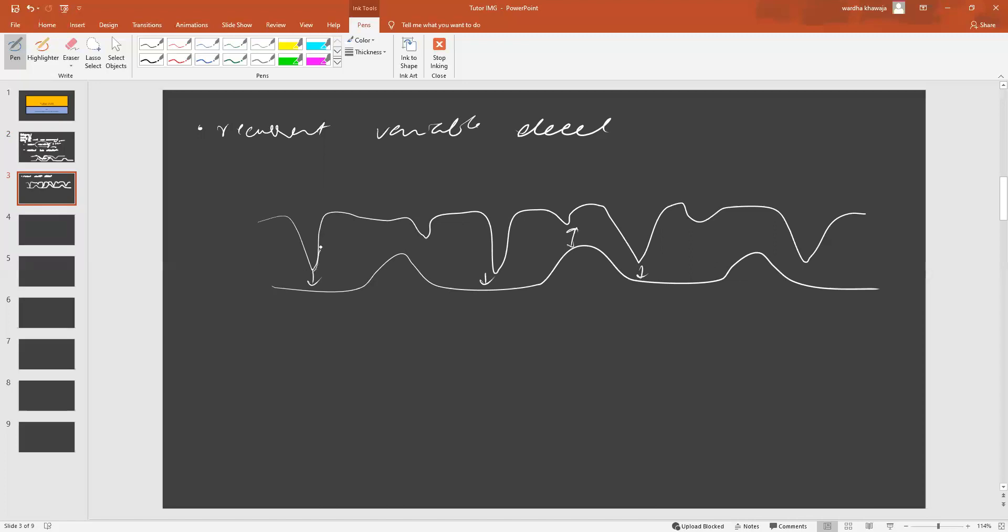This, the fact that it's rising up rapidly, is still reassuring. If it stops rising up rapidly and becomes flattened out, this is a worsening. So, this is what we mean when we say variable, recurrent, variable decelerations.